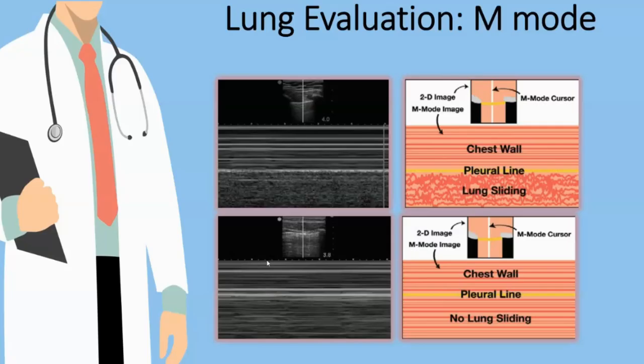Okay, so some other cool techniques that you can do to assess your lung sliding is what's called M mode. With M mode, you basically use it to accentuate lung sliding. And what's great is that you can save the still images. So medico-legally, if you've got an ultrasound machine that can print, it's great to have this in the patient's file to prove that they did have no lung sliding. So it's a great way to document an active way of seeing stuff.